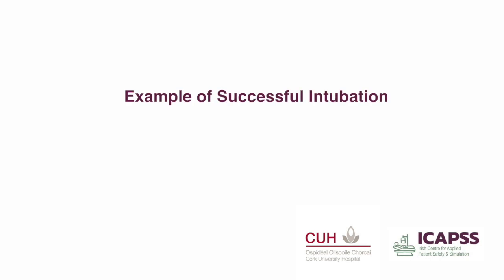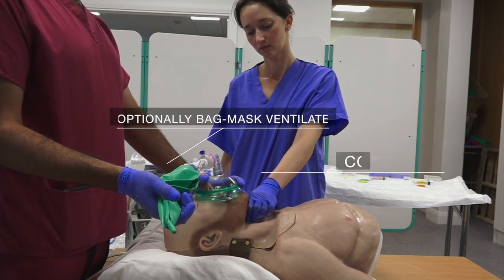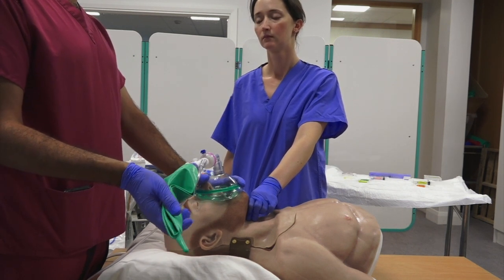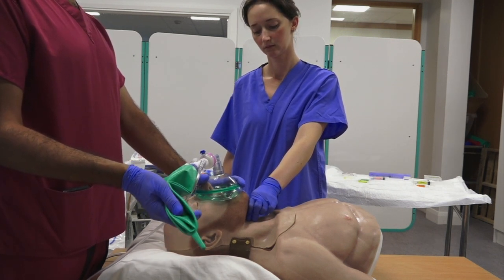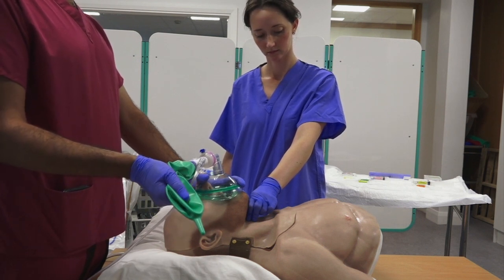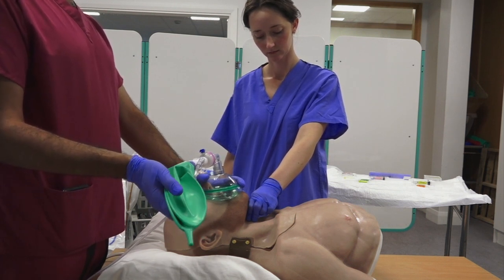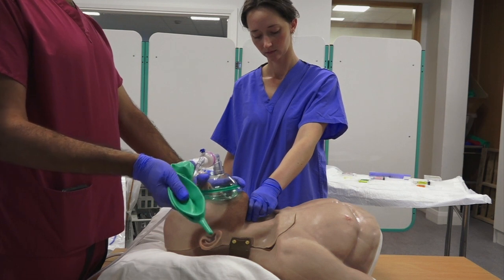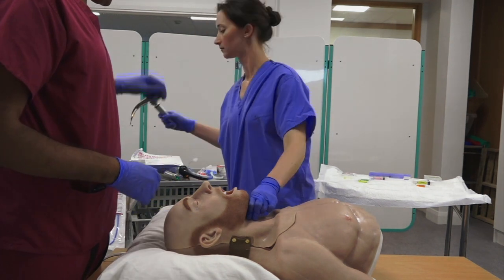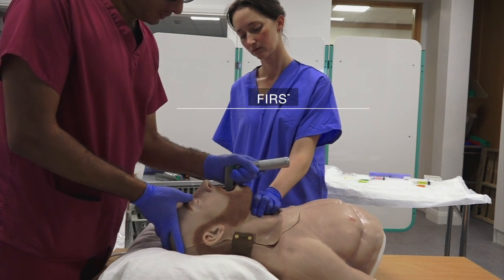Now we will demonstrate an example of a successful intubation. Pre-oxygenate and induce anesthesia intravenously. Optionally apply cricoid force; if performing a modified rapid sequence intubation, cricoid force may be omitted. Wait one minute for rocuronium to take effect; if using succinylcholine, wait for fasciculations. Once the patient is paralyzed, perform the first attempt at intubation. Here a direct laryngoscope is used, but a video laryngoscope may be electively chosen.